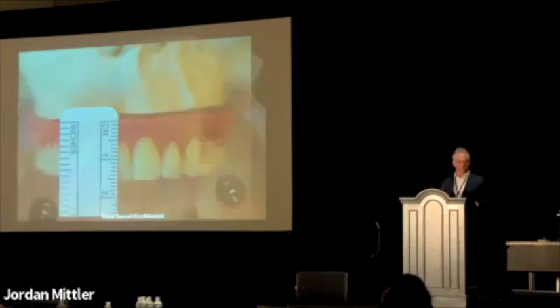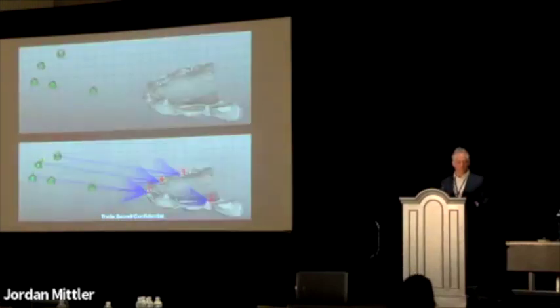30 seconds. Bone reduction, abutment selection. Okay. Again, photogrammetry just gives me this data, implants in space. I have to merge it with prosthetic data for it to be useful. Now I get that file and I can send it anywhere in the world. I can send it to your office to print. I can send it to your local lab to mill. We can mill it ourselves and ship. It doesn't matter, but the data is critical.